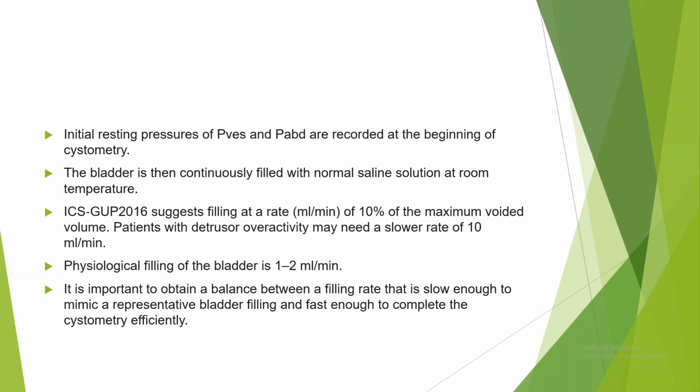Now when we start, the initial resting pressure should be recorded, and we should see that these are zeroed properly. As I showed you previously, the initial resting pressure should be set to zero. Then the bladder is filled with normal saline at room temperature.